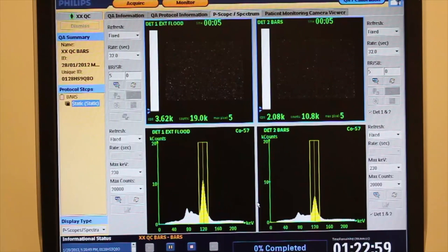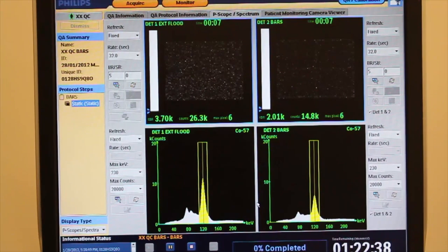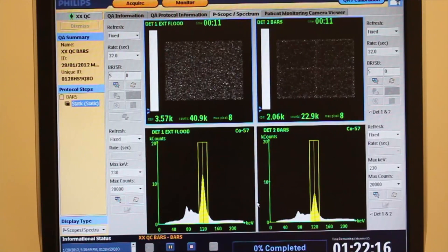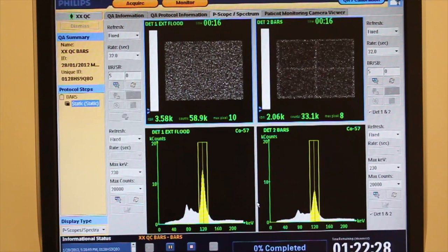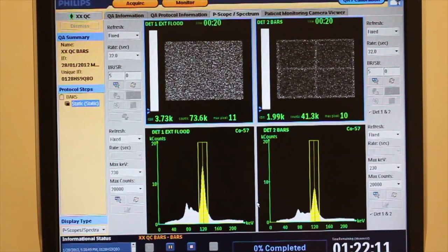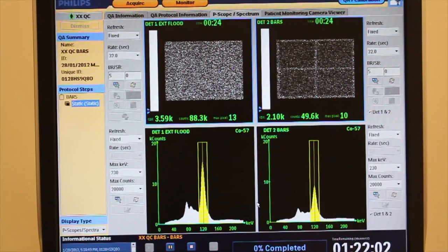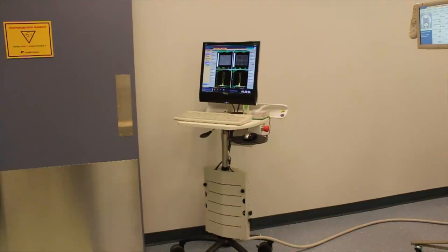Start the acquisition. Note the progress slider and ensure that the acquisition is in progress. Verify the proper placement of the bar phantom on the detector. If the bar phantom is not centered, correct the position and restart the acquisition.